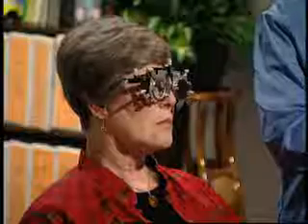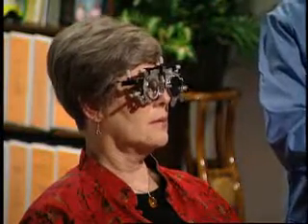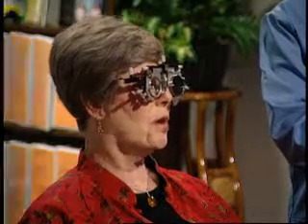Excuse me, Miss Burt. Remember, there are only letters on this chart, no numbers. Which letter do you think that is? S. Okay, you may continue. O, N, H. Subjects do have the opportunity to correct themselves if they make a mistake, but they must correct themselves before reading the next letter in the sequence.